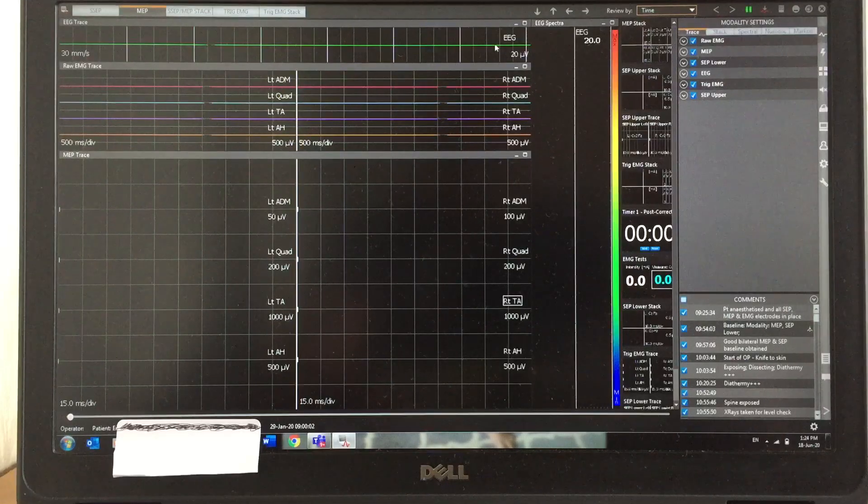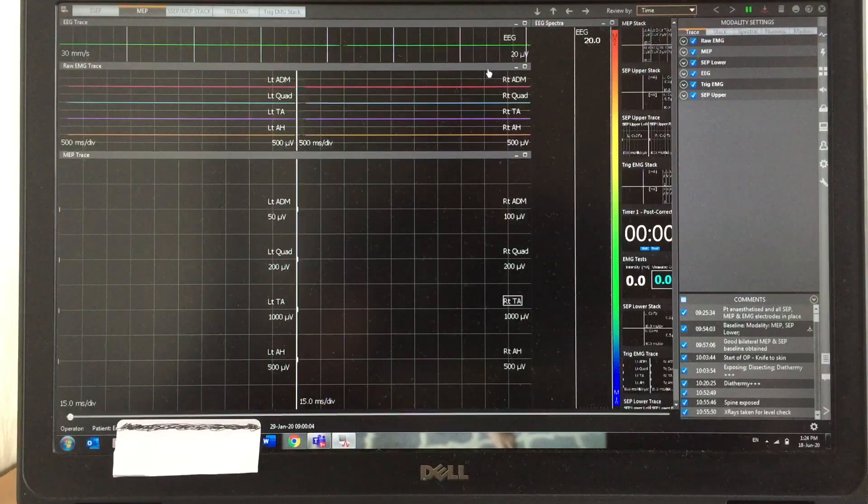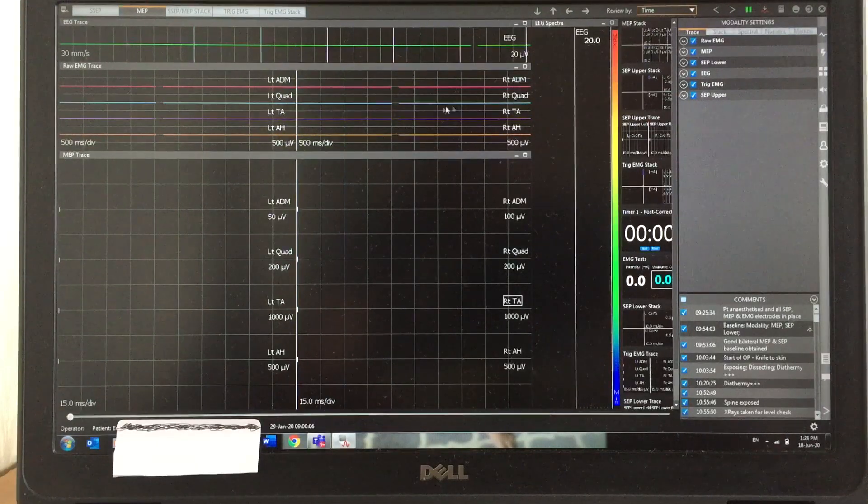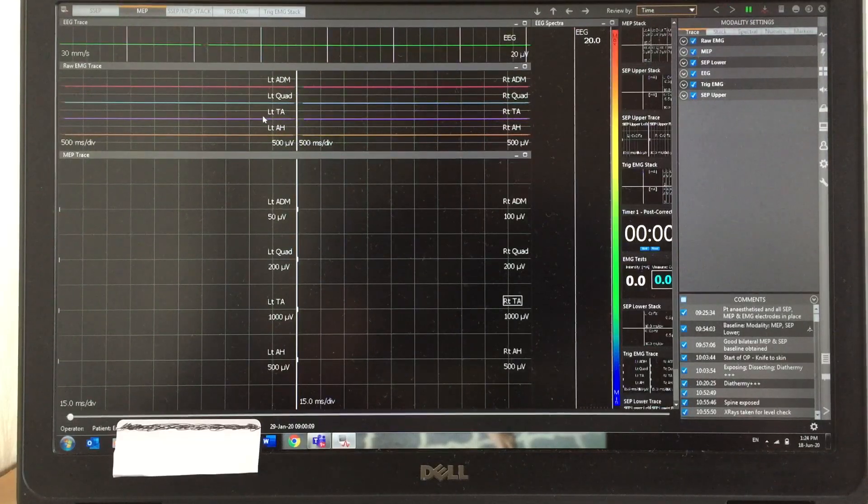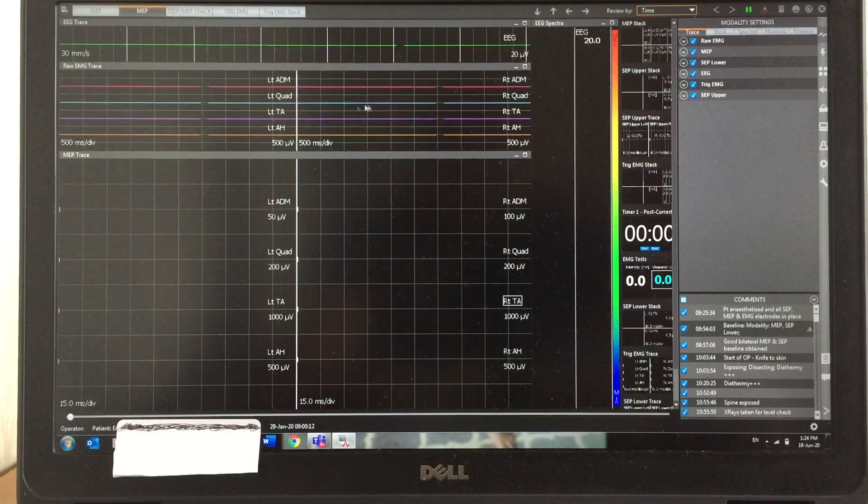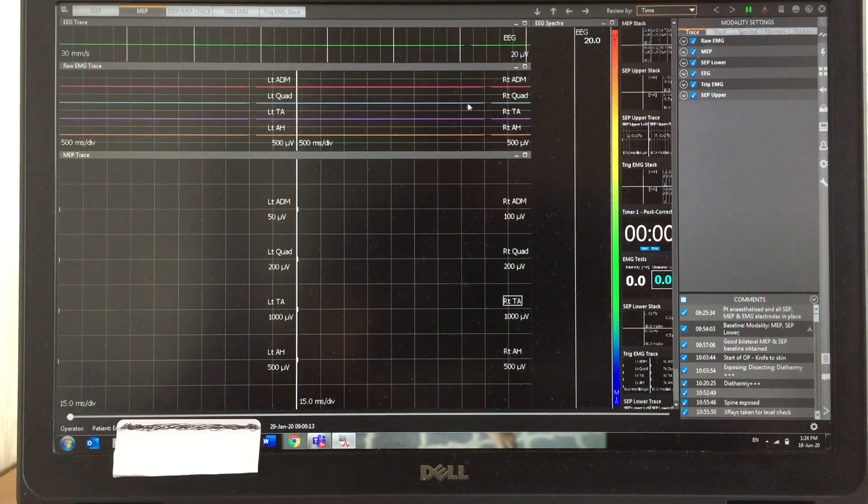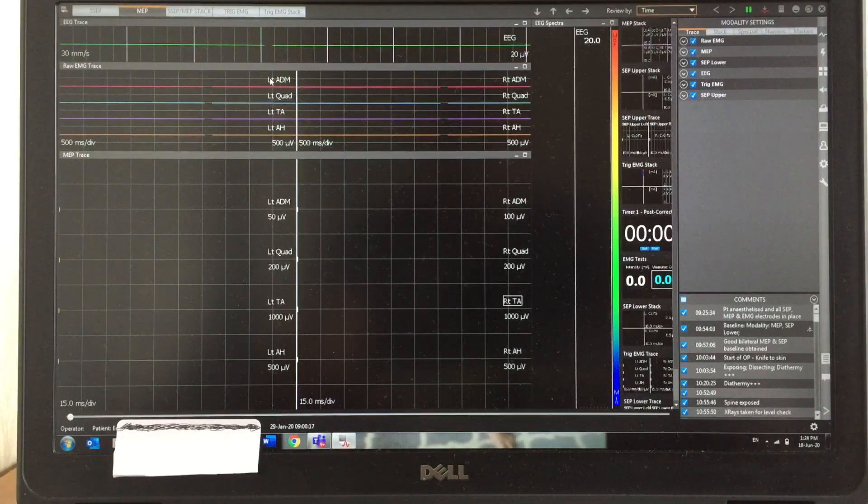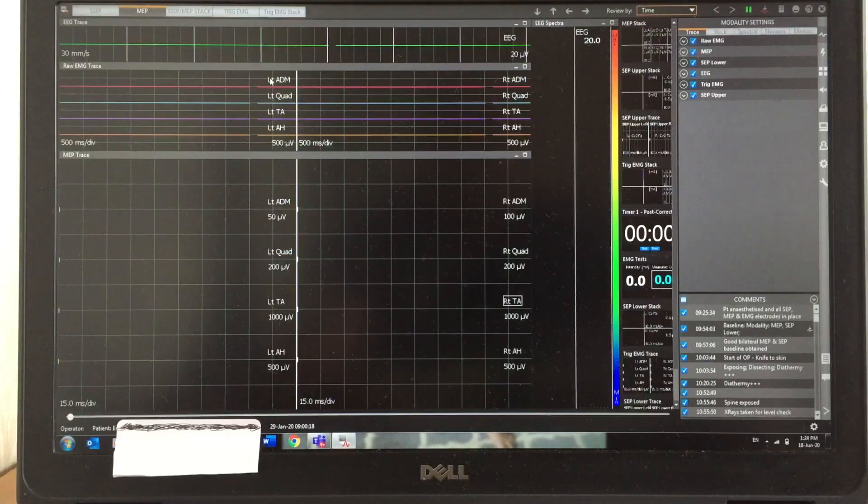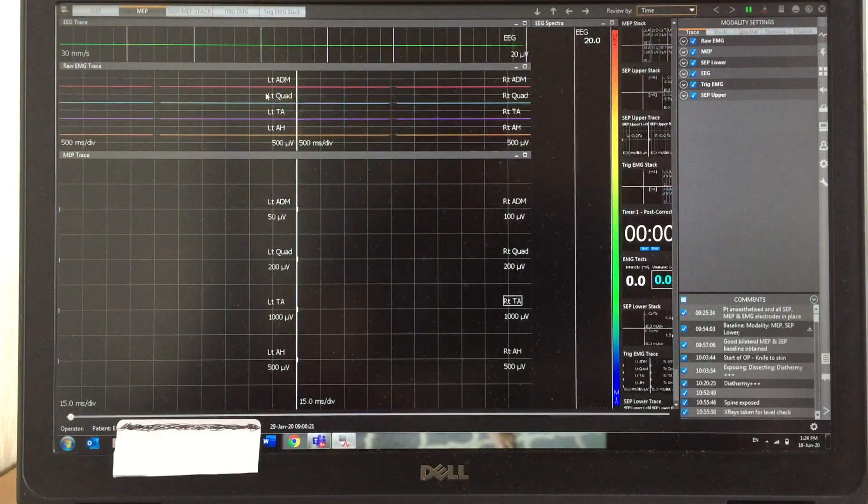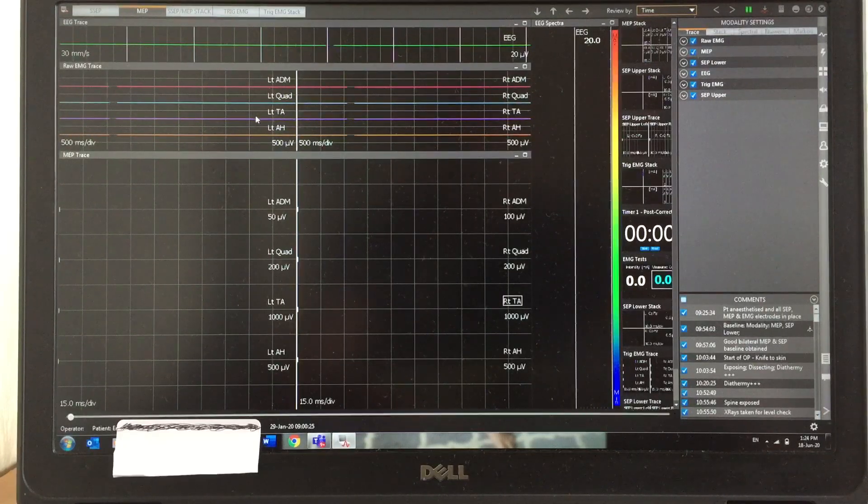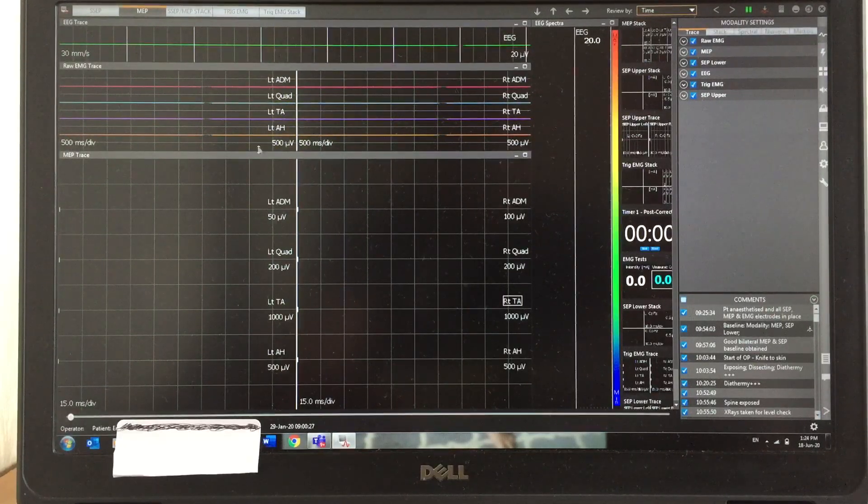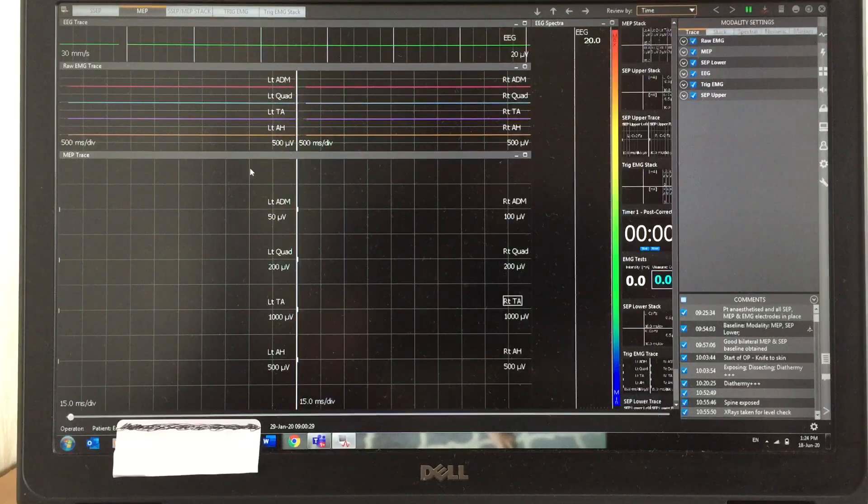These four traces are EMG, that is raw EMG left and right side. You can see the muscle names: ADM (abductor digiti minimi), quadriceps, tibialis anterior, and abductor hallucis. The bottom one is the MEP trace with the same muscles.